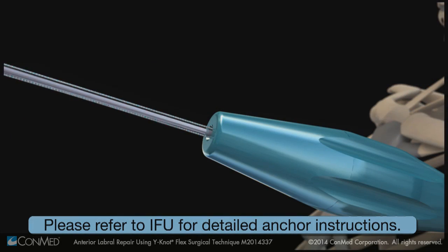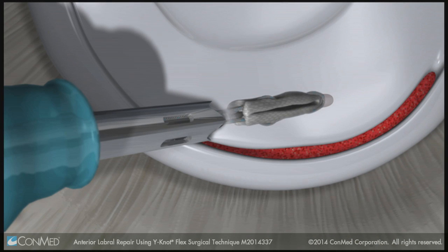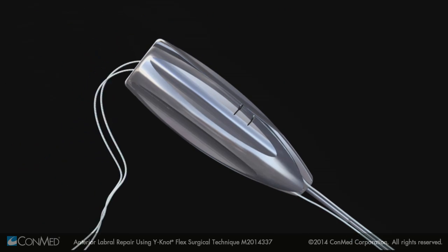Advance the Y-Knot anchor into the pilot hole with gentle mallet taps while keeping the guide still. Release the sutures and remove the drill guide.